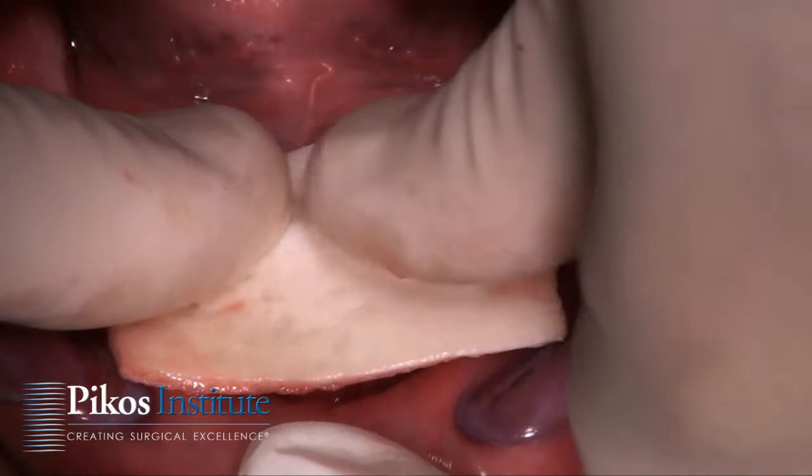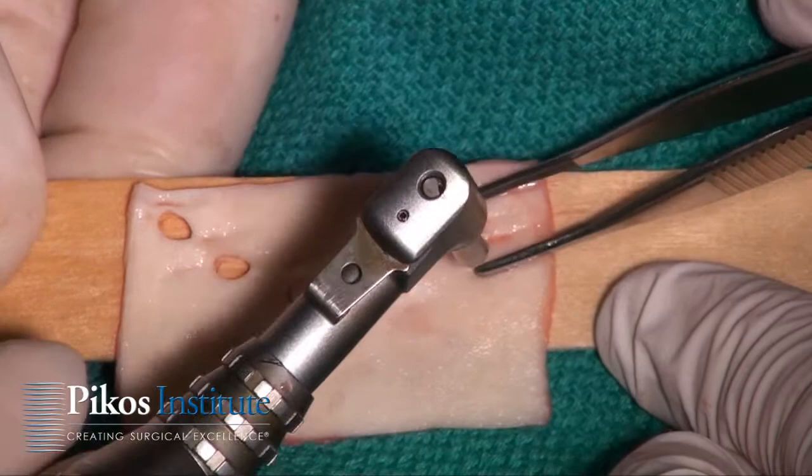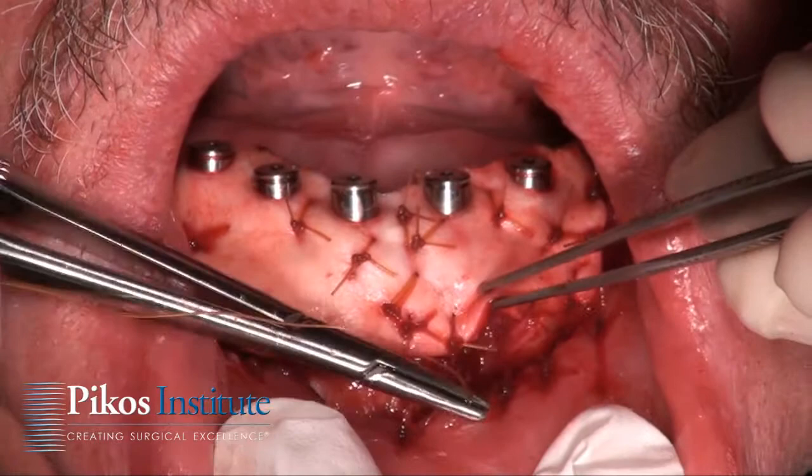We're going to imprint the ADM so that I can very conveniently and nicely outline these. Then just a series of interrupted sutures — this 3-0 chromic and the small needle allows us to penetrate the ADM.